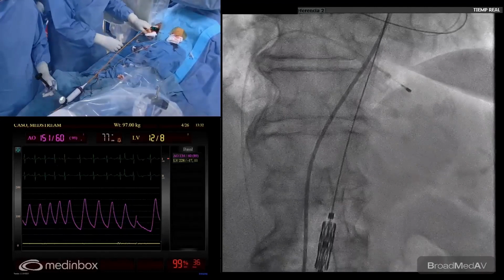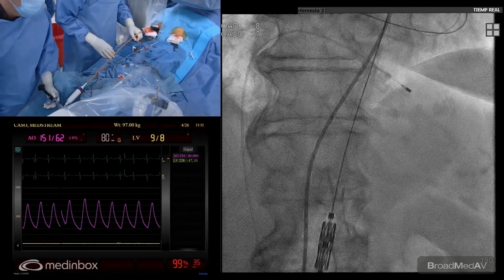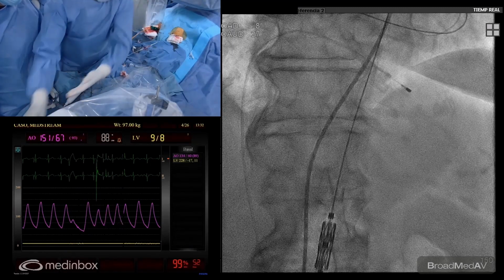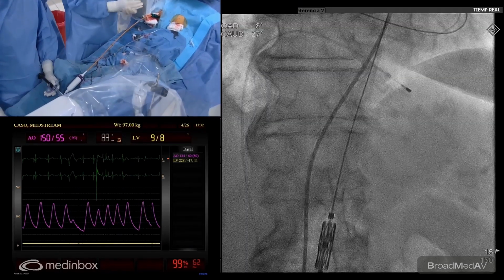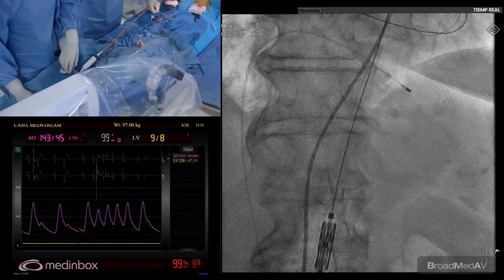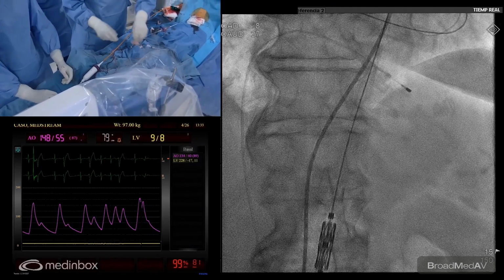As you see, this is a check that the valve is in the middle of the balloon because you have the points that are very well distributed. So this is a good check. And now we know that we are fine. Great. So probably we can describe something here.